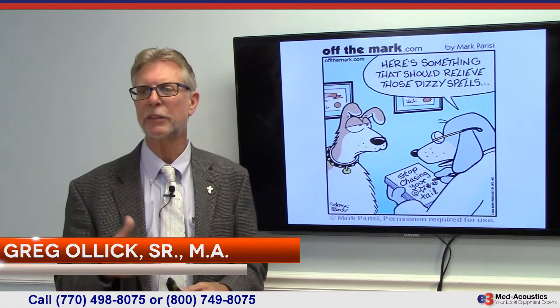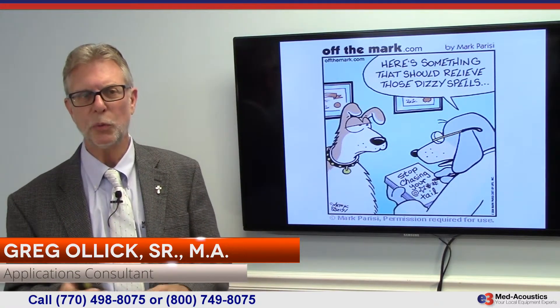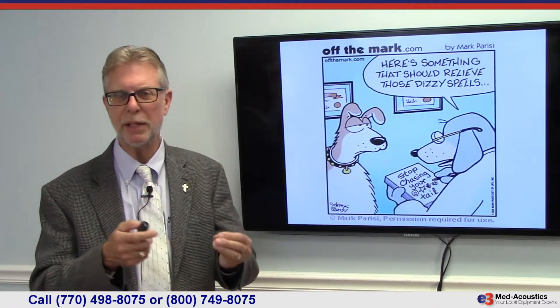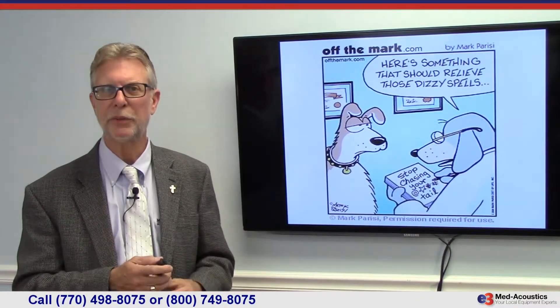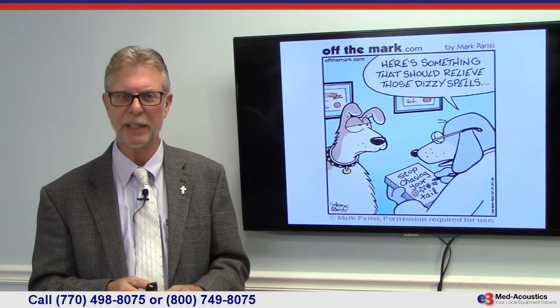We're going to use the Interacoustics Eclipse equipment to actually do a C-VEMP and an O-VEMP, and you'll be able to see the test in action — electrode placement and everything else. This is the electrode montage for the C-VEMP.